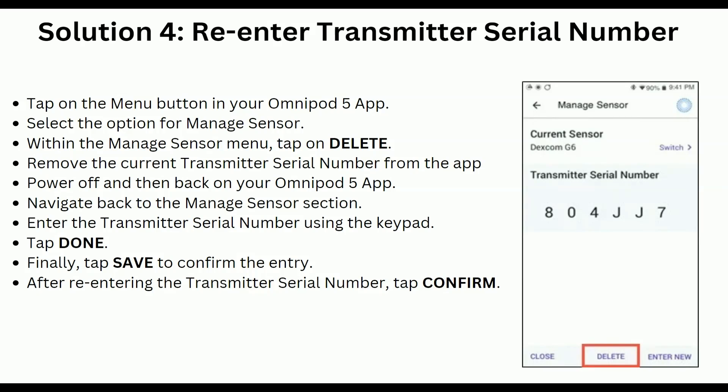Solution 4: Re-enter transmitter serial number. Tap on the menu button in your Omnipod 5 app and select the option for Manage Sensor. Within the Manage Sensors tab menu, tap on Delete and remove the current transmitter serial number from the app. Then power off and back on your Omnipod 5 app.